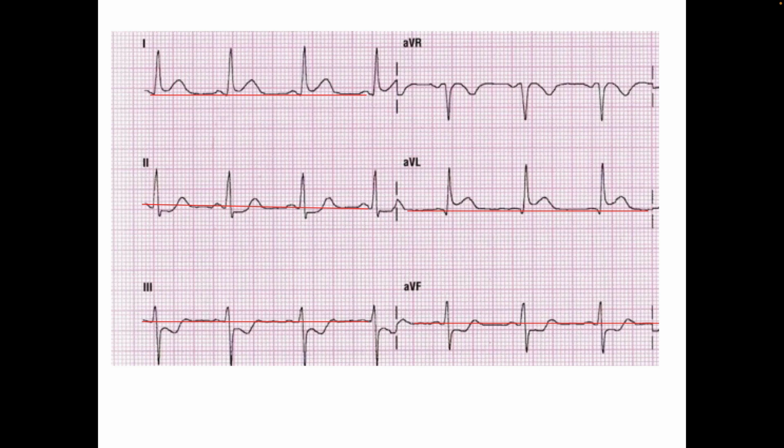So for example, if the pattern really suggests a STEMI, there's a bunch of ways you could treat it. One way is to start code 3 towards your cardiac hospital, do another 12 lead in 10 minutes, and if nothing's changed, then call it. But it's also very possible something will change. So it's hard to answer that without the specific 12 lead, but we're going to be seeing plenty of borderline ones where we can talk about it.